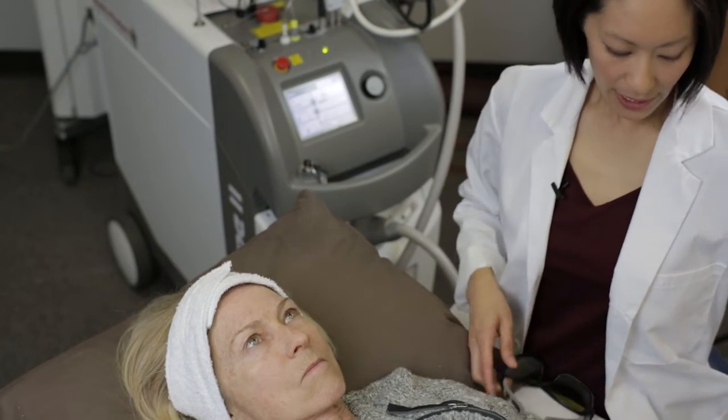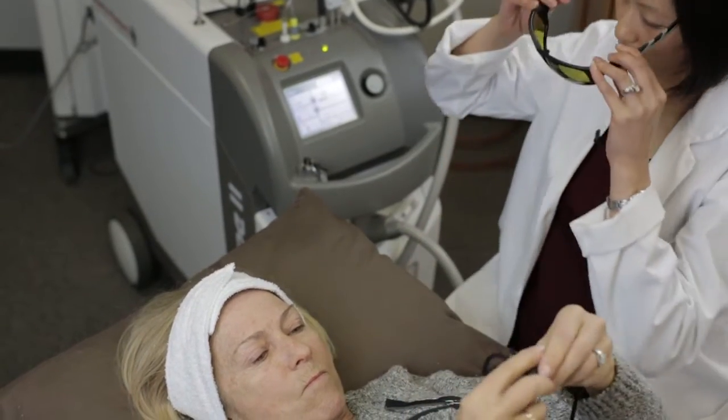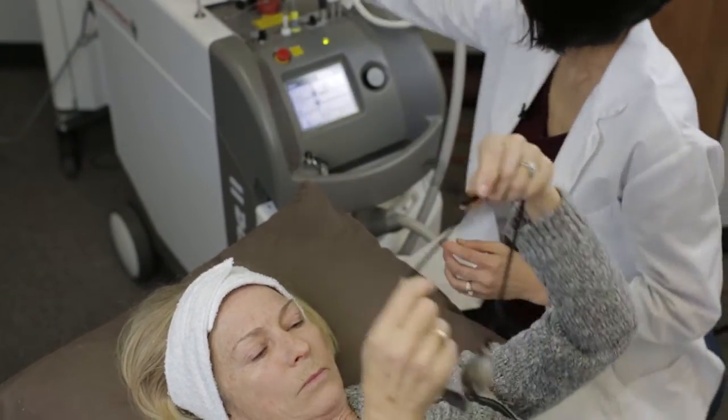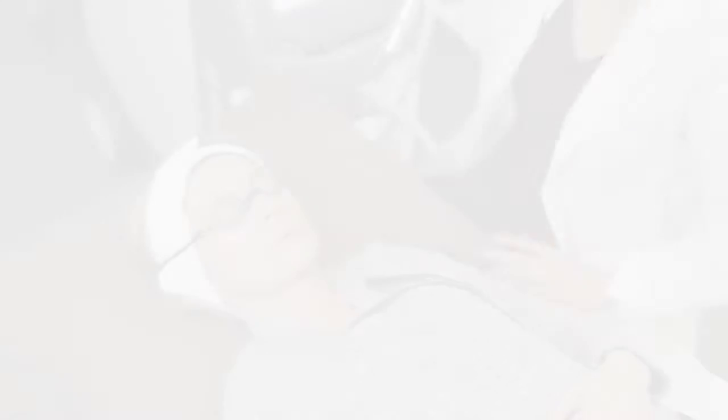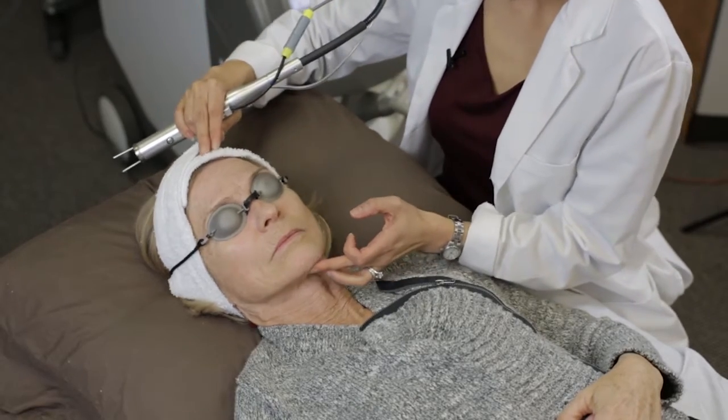So we're going to get started, and I'm going to have you put on these safety goggles. I'm going to start on your left cheek, so turn to your right just a little bit.